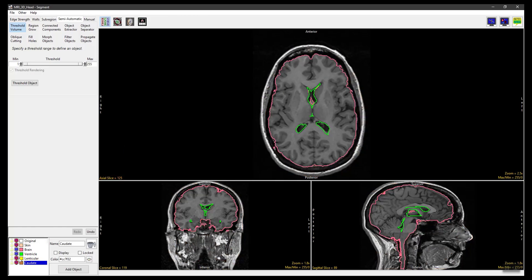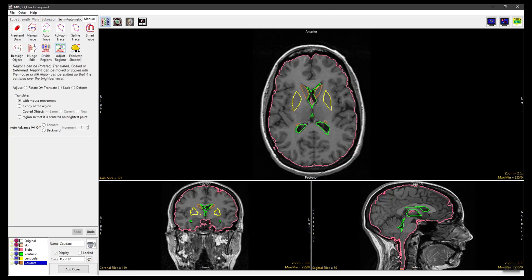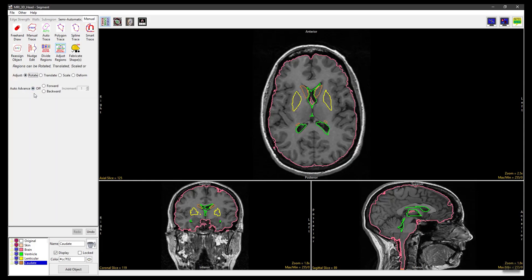In the Object Controls panel, switch off the skin object and switch on the lenticular and caudate objects. Now select Manual, choose Adjust Regions and set the Adjust Method to Rotate. Click in an object to select it and move the mouse up or down to rotate the object. Release the mouse button to end the rotation and commit the rotation to the object.